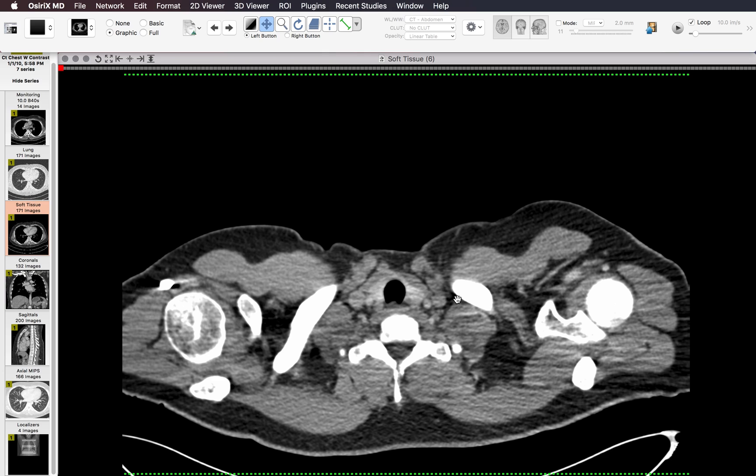You don't have to follow up every nodule. I usually use the ACR guidelines on whether to follow up a nodule, which is based on size and the age of the patient.